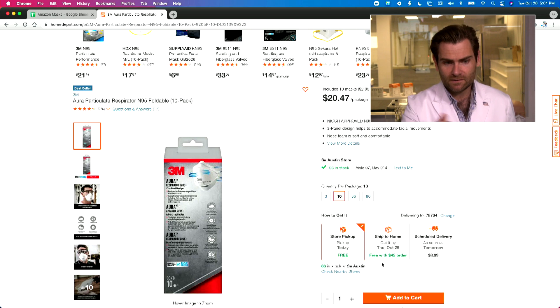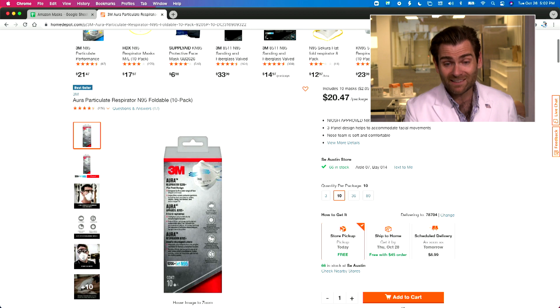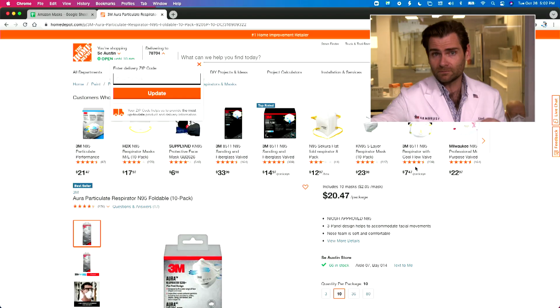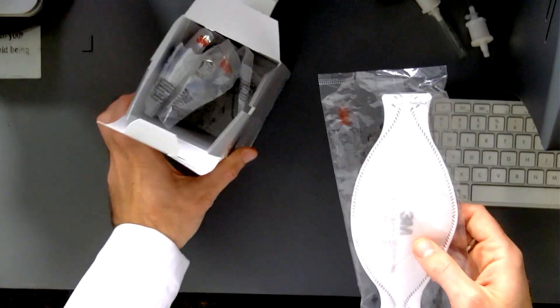Looking at the listing on Home Depot's website: you can buy a 10-pack for $20.47 — that's two dollars a piece. I love the little box design, which I'll show you in a second. These are widely available. You may remember at the peak of the pandemic this was the mask everyone wanted. The 9205 is the mask of choice, and I'll show you why.